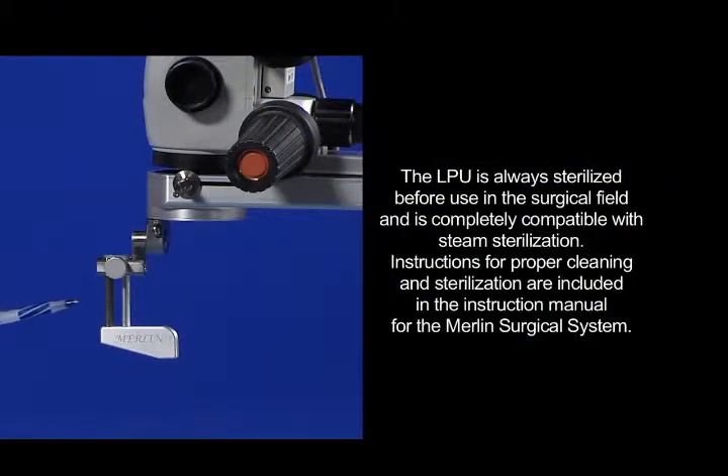The LPU is always sterilized before use in the surgical field and is completely compatible with steam sterilization. Instructions for proper cleaning and sterilization are included in the instruction manual for the Merlin Surgical System.